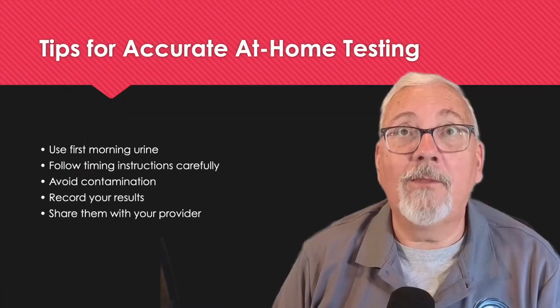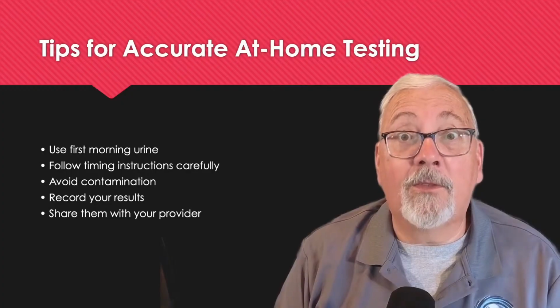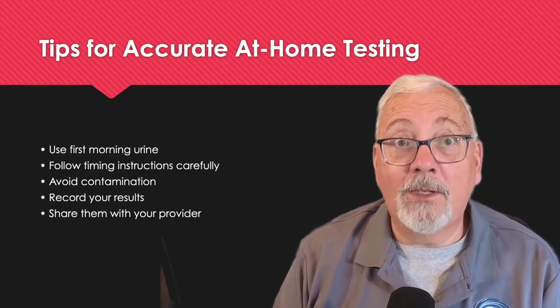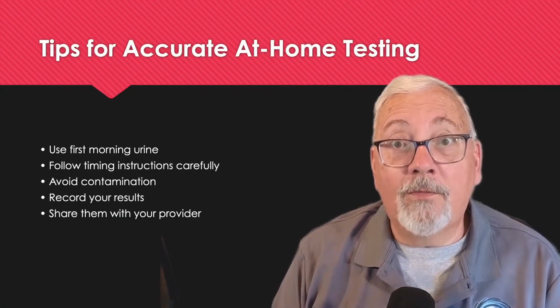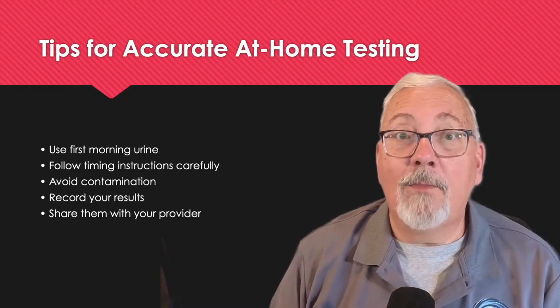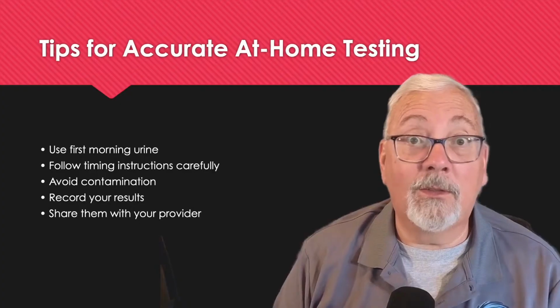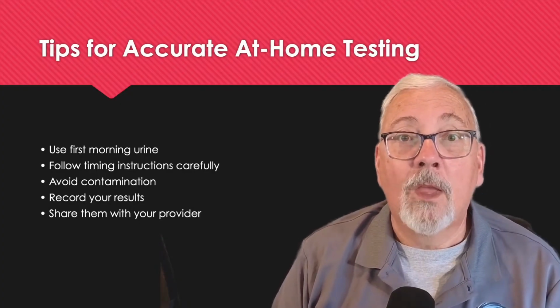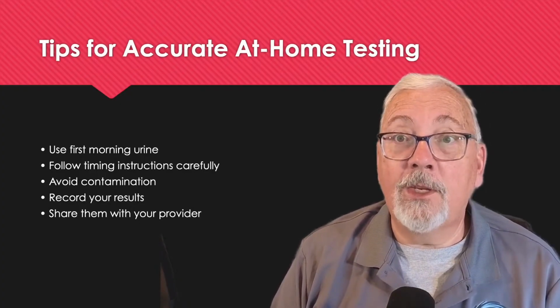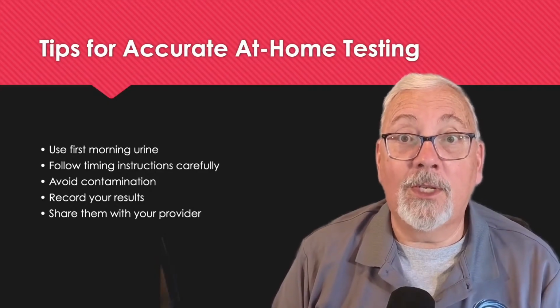That's the best way. Now, here's some tips to get the most accurate results from your at-home testing. So always follow directions carefully. Read the labels and maintain clean testing conditions. Don't contaminate the sample because it could be affected. Always wash your hands and use a clean catch midstream urine sample to reduce contamination.